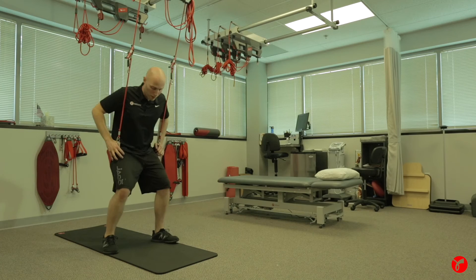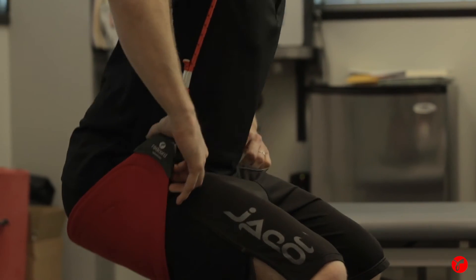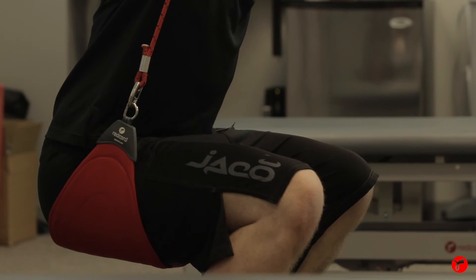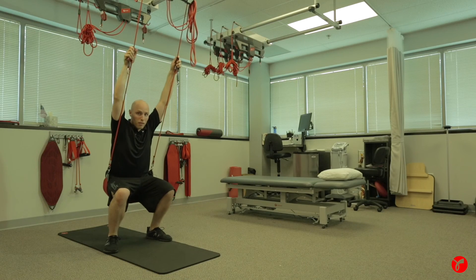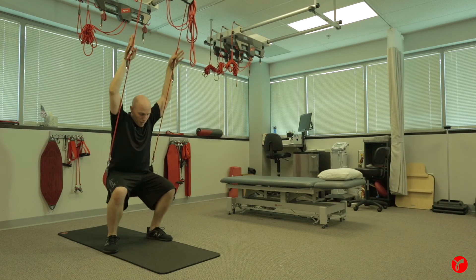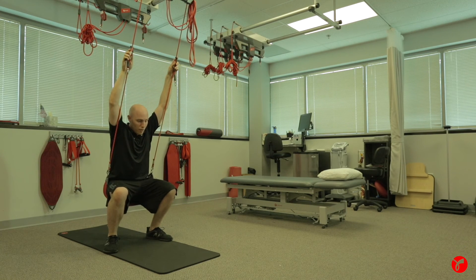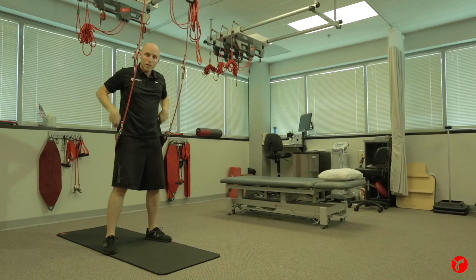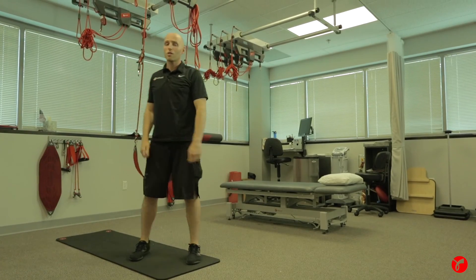Now we can sit back into the sling and get into the proper squatting position with off-weighting. As I come down and step back, I can get into the proper squat position. I can even bring my hands up to work on an overhead squat and the mechanics — coming up and down. And obviously as they progress, you can take away some of the body weight until the point that they don't need the bungees anymore.